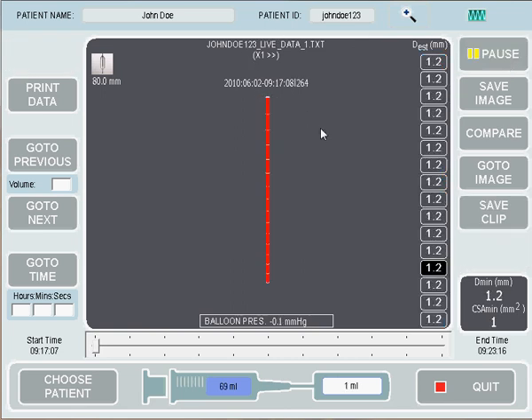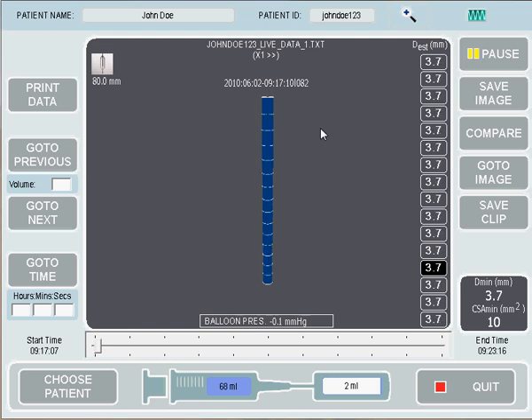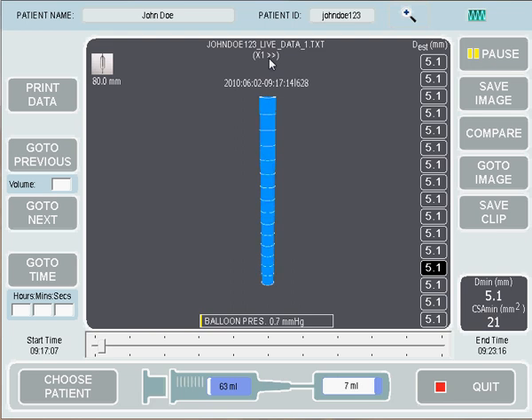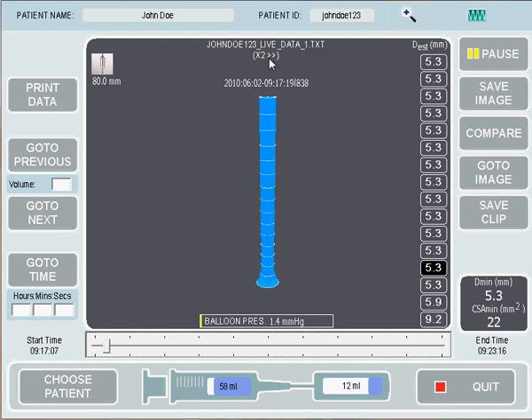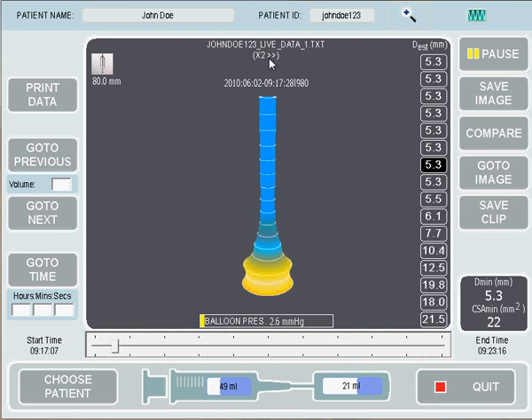If we press Play, it will start playing the procedure like we were in the procedure. At the moment it's playing at regular speed, so it'll play for the length that the procedure took. Using our keyboard, we can press the up arrow, which will increase the speed. Every time we press it, it'll increase it by another amount — so at the moment it's increased by a factor of 2.